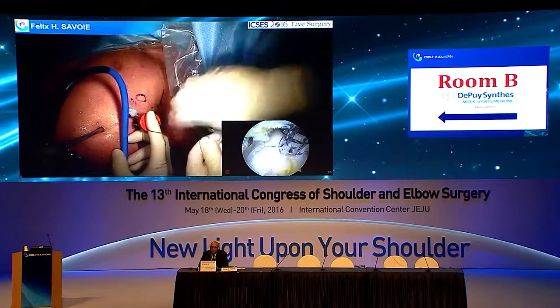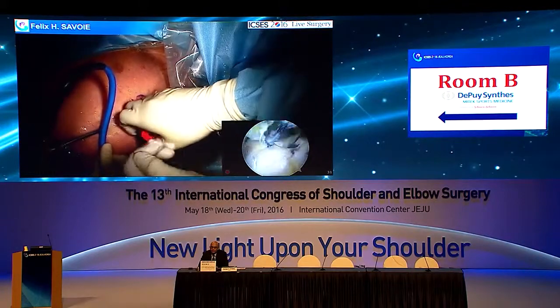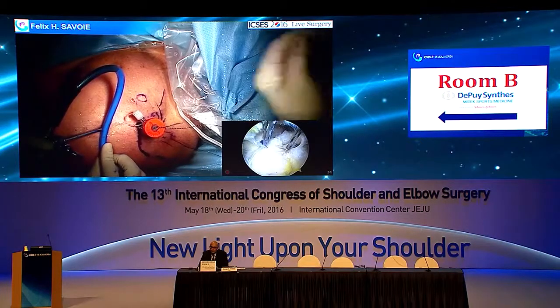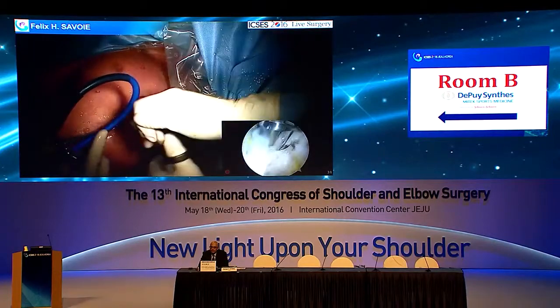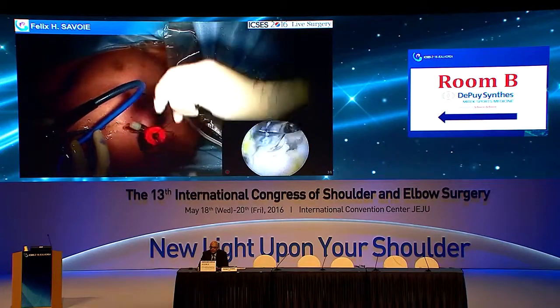And you can tie back to front or front to back. I don't think it matters. I used to think it did, but now I don't. I just hadn't noticed any difference. And so here we are, we're putting it down, and we'll tie this. And make sure that our front part of our supraspinatus is back where it's supposed to be. And then we'll cut one of these and save one.